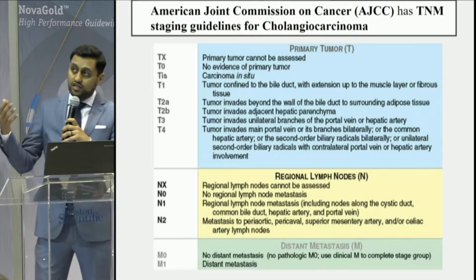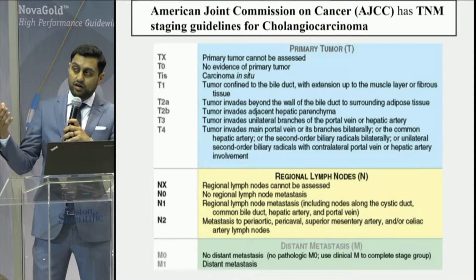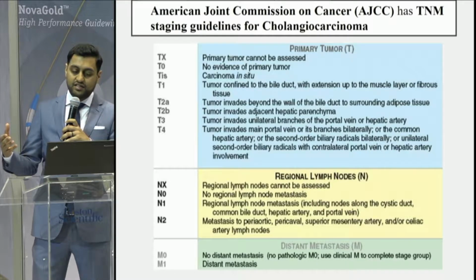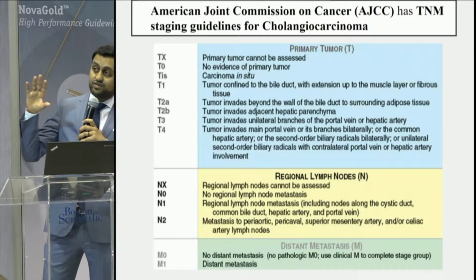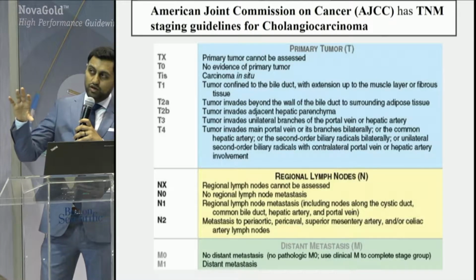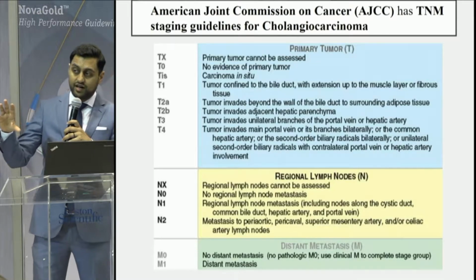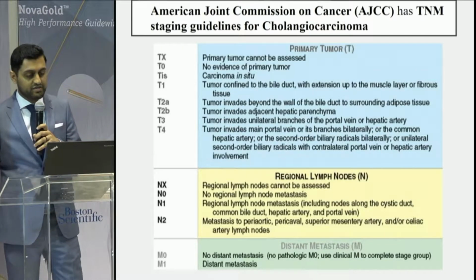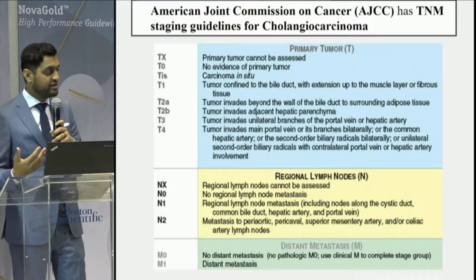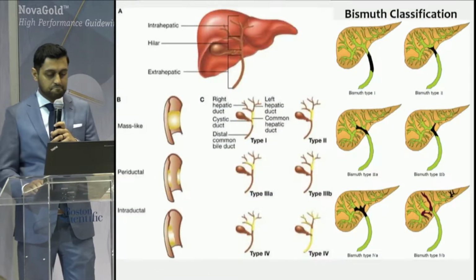As you can see, this can be determined using a combination of cross-sectional imaging, EUS, and/or SpyGlass cholangioscopy. It does not address ductal invasion directly, and that's really important to understand. We're really talking about vascular involvement, size of the tumor, and lymph node involvement when we talk about TNM stage. I think we can really add to that in terms of the involvement of the biliary ducts, which is what we aim to show today.